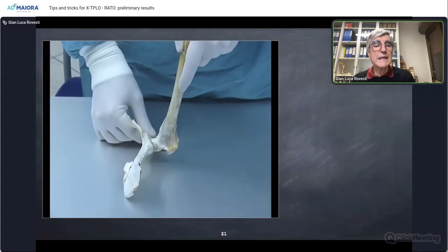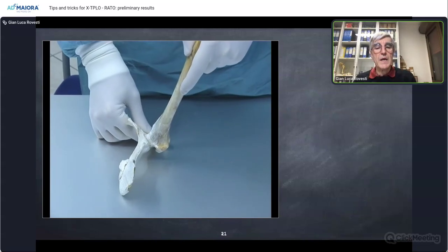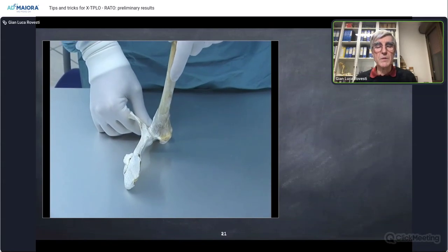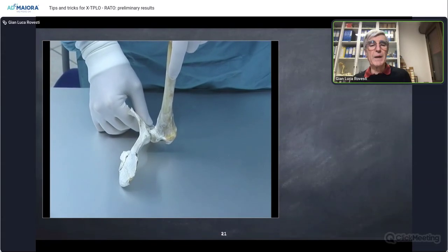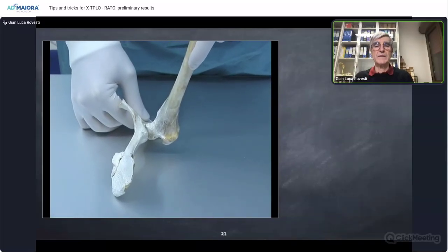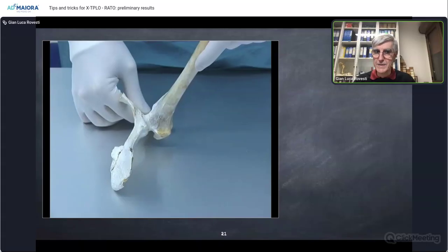And this is the reduction angle. If we get back to the vertical or horizontal position, we can feel the subluxation happen again. And this is the subluxation angle. And these two angles are mandatory for our evaluation of the case.